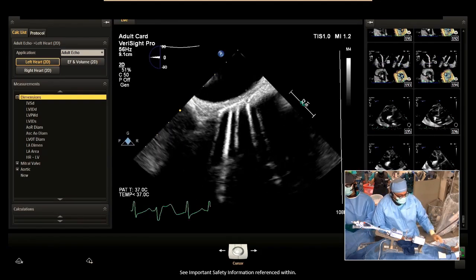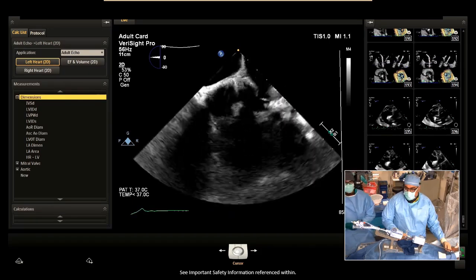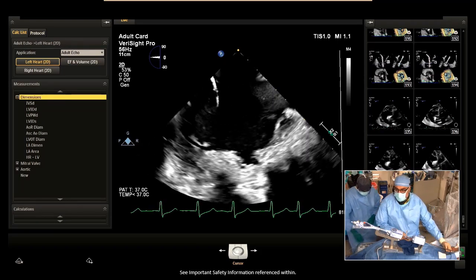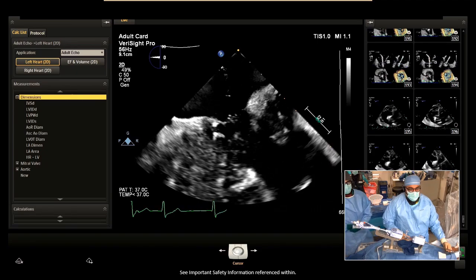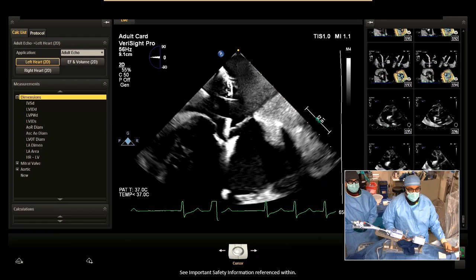Okay, 3D ICE is live now. Okay. So I'm kind of looking in the wrong direction. I'm going to go ahead and rotate around to start looking down at the imaging there. And I'm going to go ahead and, let's see here, optimize my 0 degree view. Okay, Edris, that's my 0. Let me see if I can. Okay, so that's 0 there.